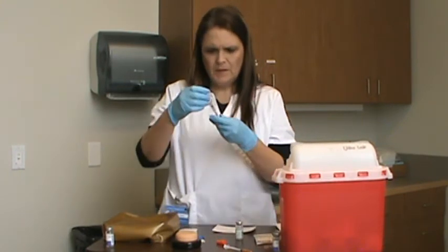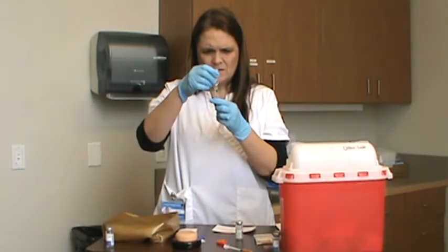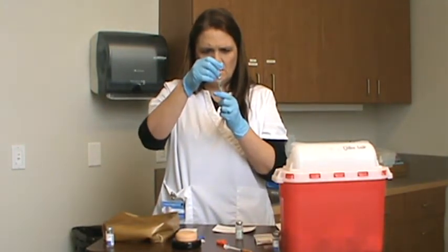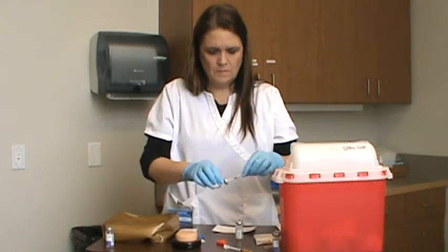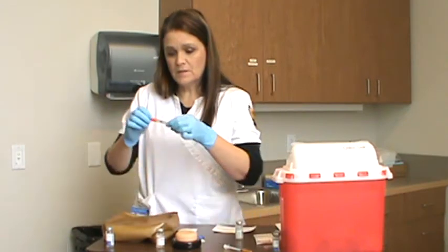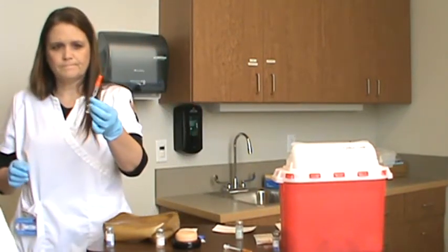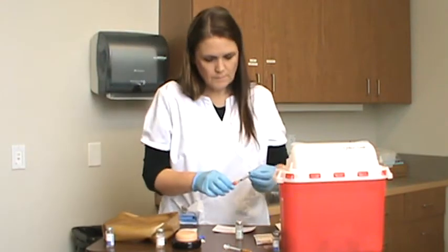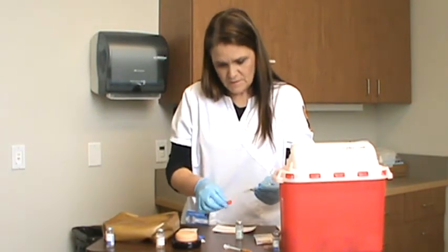So I would draw up the 9. Because this is another high-risk drug, I would check it with another nurse to make sure that it is indeed 9. So I'll show my nurse that this is 9. Yep. And then I will draw up the 16.